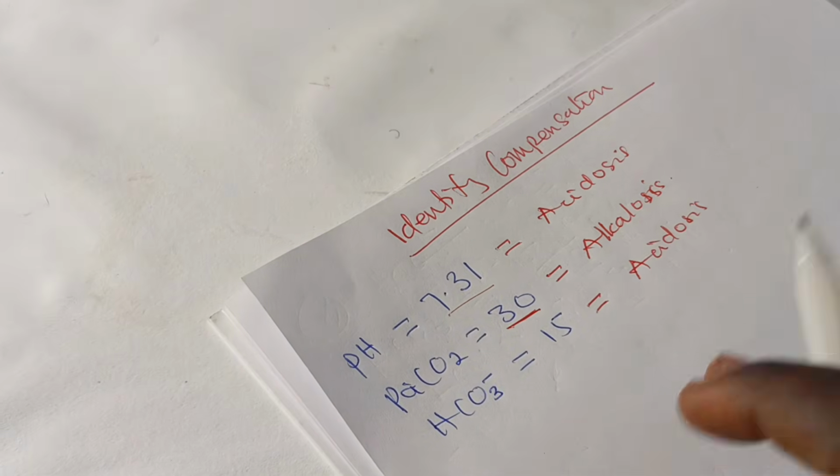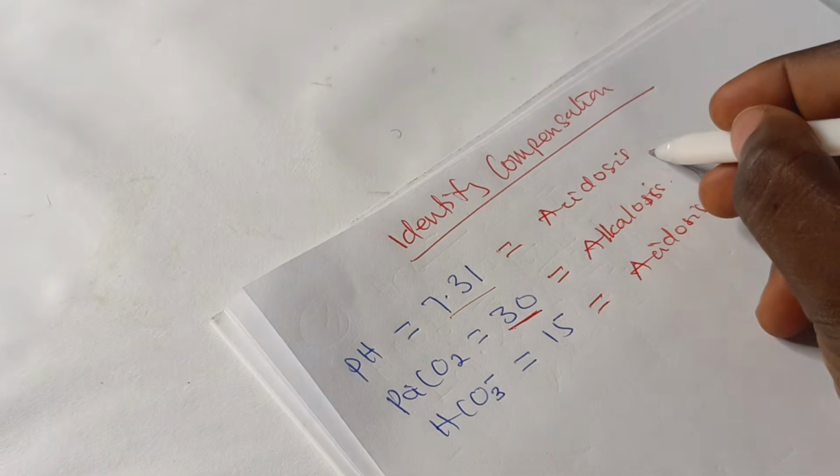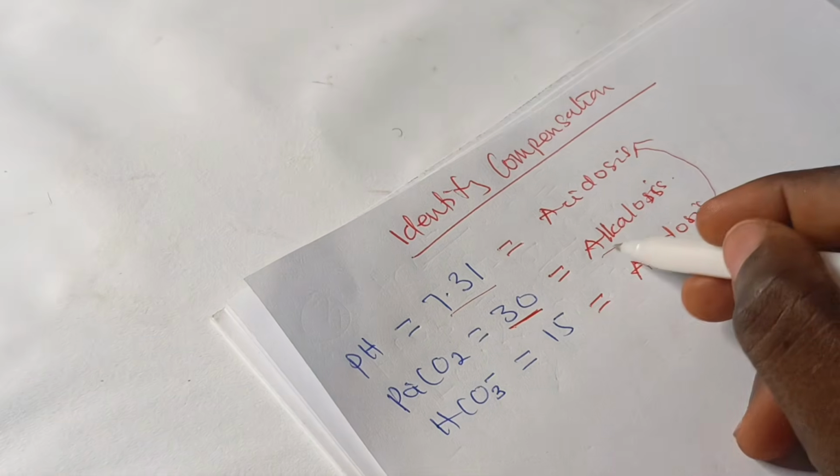So if you look at this and this, they've agreed, but you can't just say it's a metabolic acidosis simple like that, because there's a problem here.